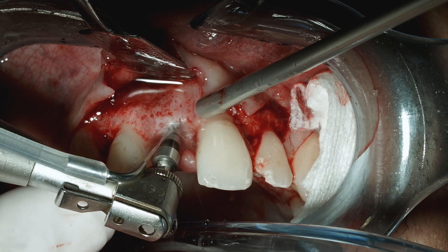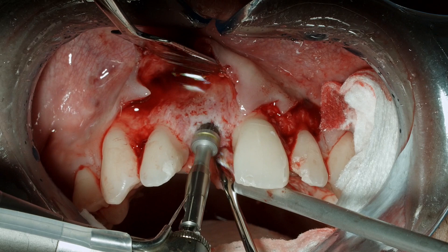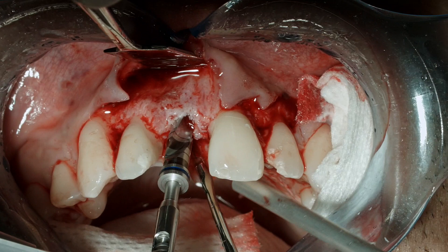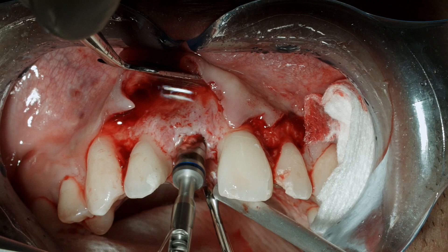Here going to the number three multi-drill, and we're going to a depth of 13 millimeters to the bottom of the final black line to account for the level of countersink desired for the implant placement. Here the final drill is going to be the number four multi-drill to place our four by 13 millimeter fixture, drilling to the full depth for the desired placement.